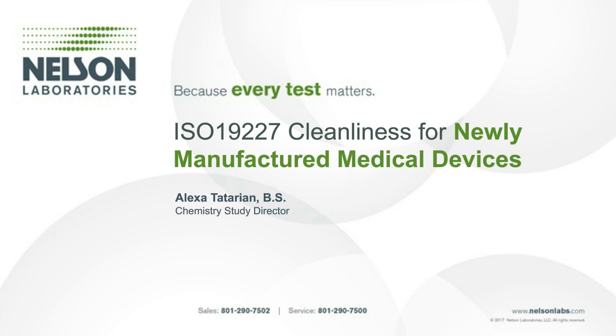I deal a lot with single-use devices such as orthopedic implants or spinal implants, a lot of implants, but we can also use this testing for reprocessed or reuse devices if the manufacturer is again looking to target those types of manufacturing residuals, so maybe first-time use, and then we'll discuss later today those reprocessing and reuse cleaning validations. But right now, starting off with cleanliness testing for newly manufactured devices.